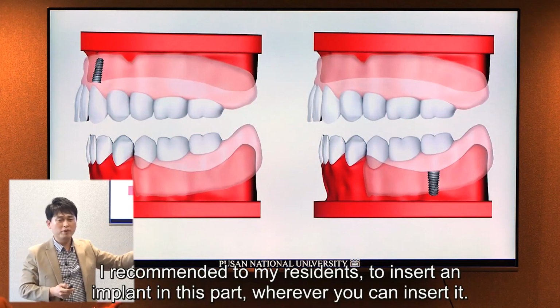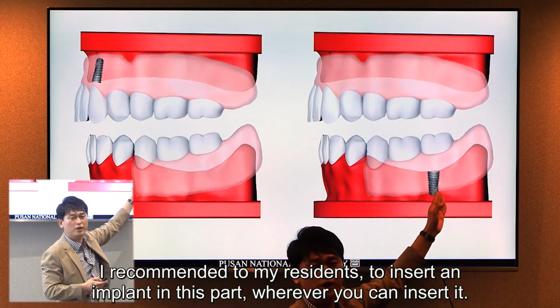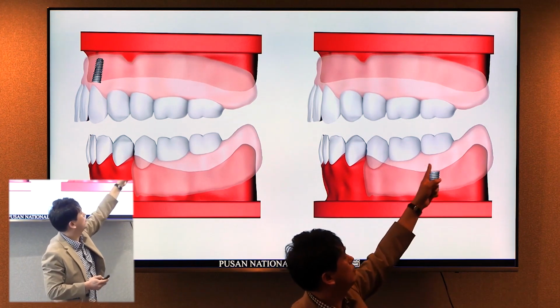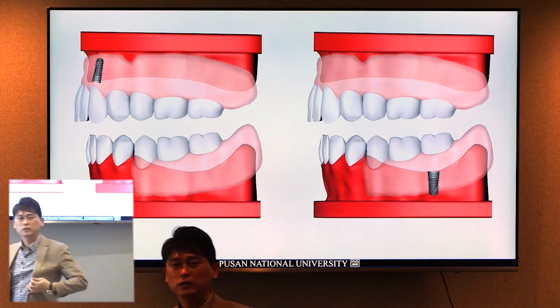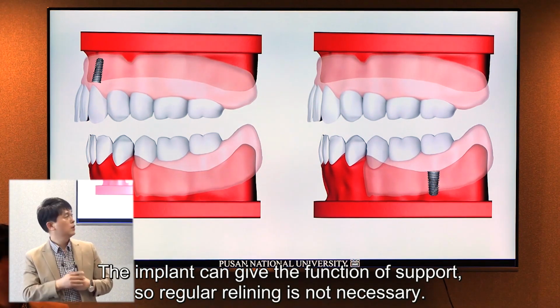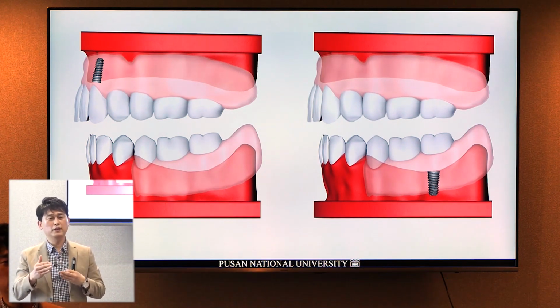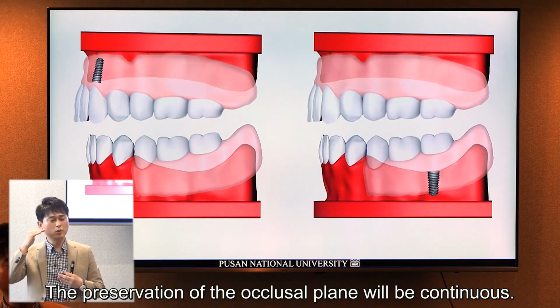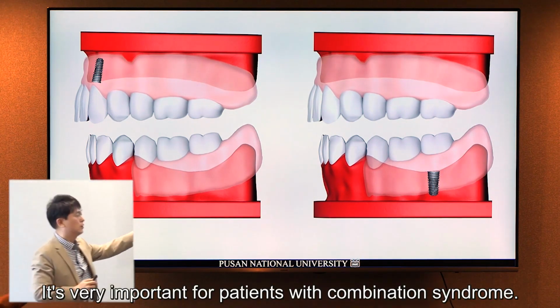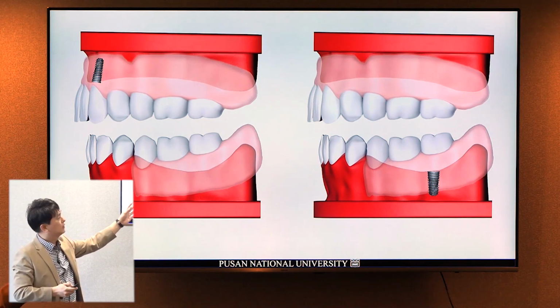I recommend to my residents to insert an implant in this part wherever you can, and then connect the healing abutment. The implant can give the function of support, and then regular relining is not necessary. And then maintaining the occlusal plane will continue. So it's very important for a patient with combination syndrome. We have to remember.